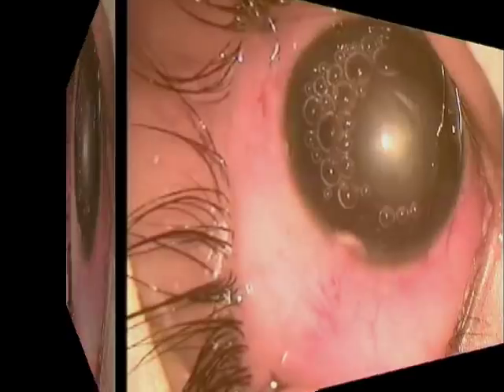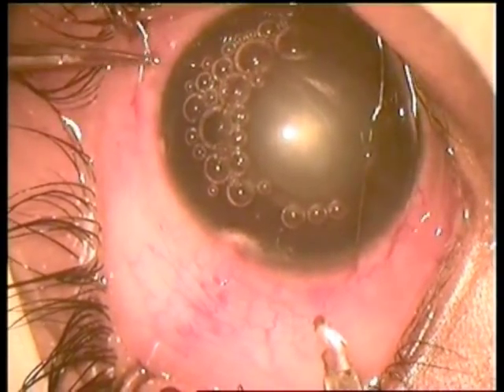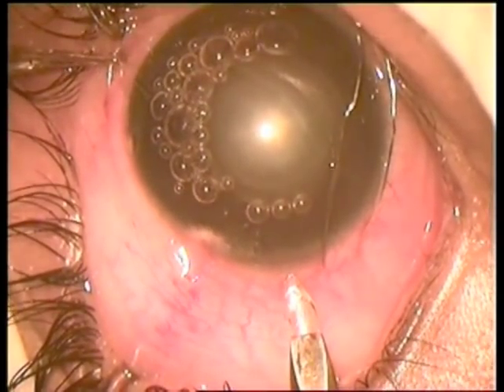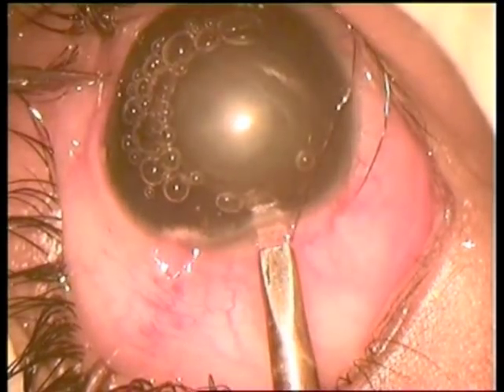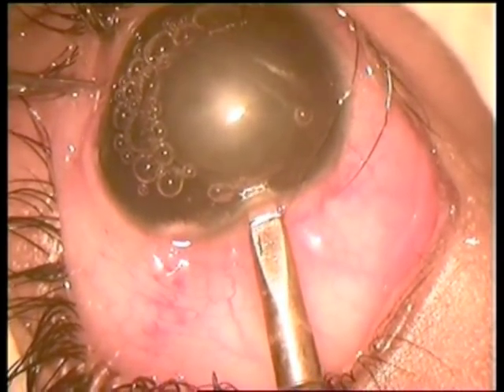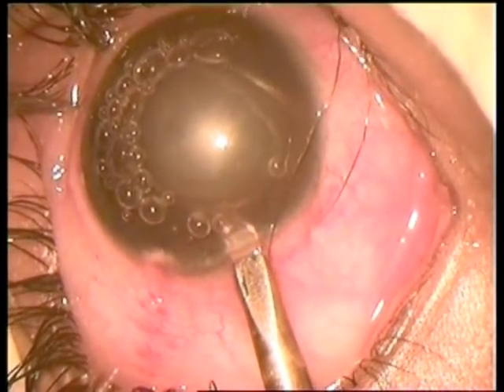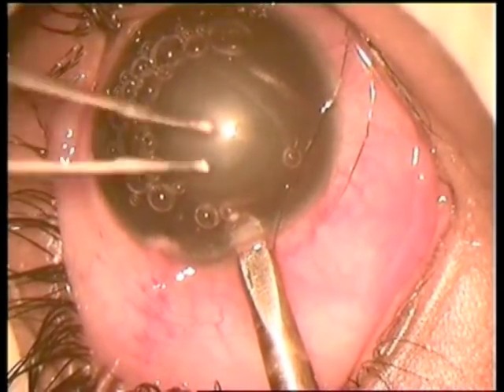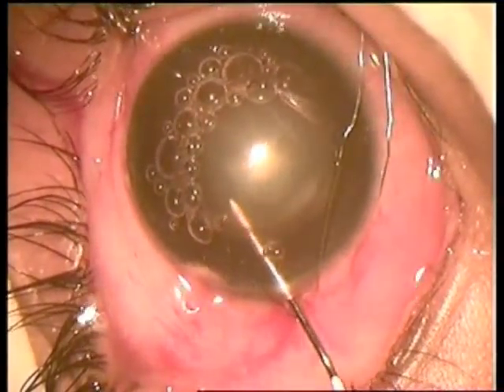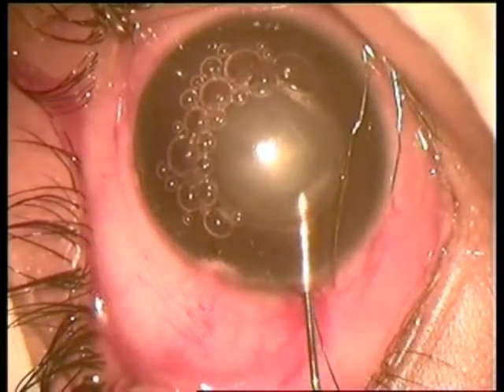The work is not yet over — we have to deal with the lens, which is occupying the pupil and is adherent to the pupillary margin. A one-and-a-half millimeter pocket section is made with a diamond knife, and capsulotomy is done with a pointed needle.